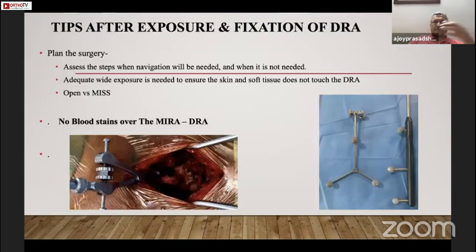Therefore, after exposure, the first part is the fixation of the DRA, or the dynamic reference array. The plan is you have to always assess the steps when navigation will be needed and when it is not needed. Adequate wide exposure is necessary if you are planning to do an open surgery, so that there is space for you to fix the DRA. And it varies between open and MIS.